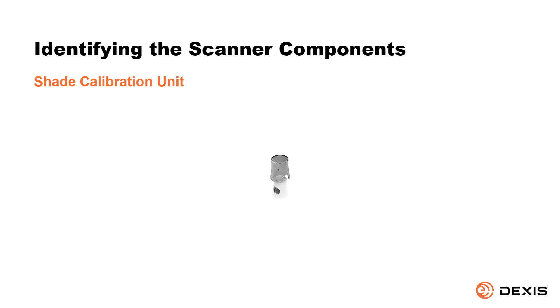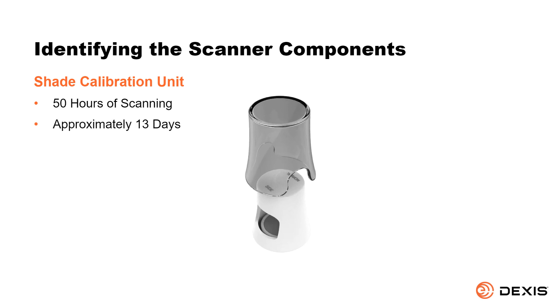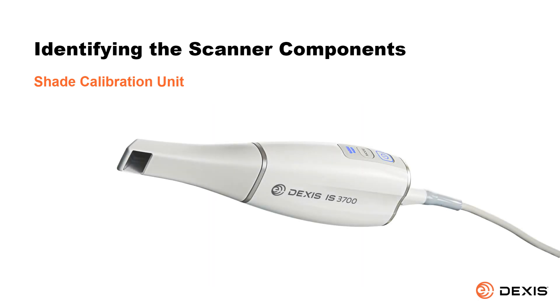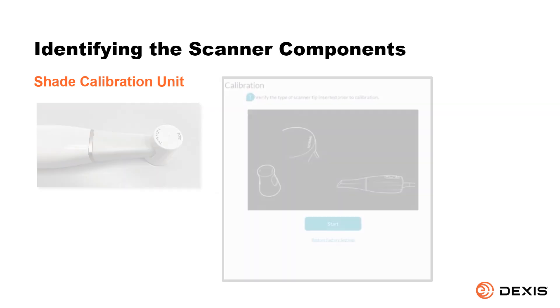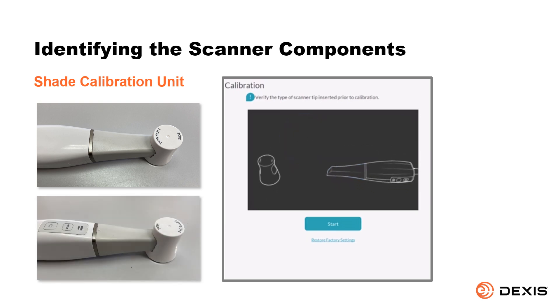Shade calibration unit. After 50 hours of scanning — approximately 13 days — use the shade calibration unit to recalibrate the scanner. Keep the cap on the calibration unit until you are ready to use it. Always install a cleaned and sterilized tip on the scanner before attaching the shade calibration unit. Attach the shade calibration unit to the normal tip using the normal opening, or to the side tip using the side opening. Be sure to push the shade calibration unit to the end when attaching to the tip.